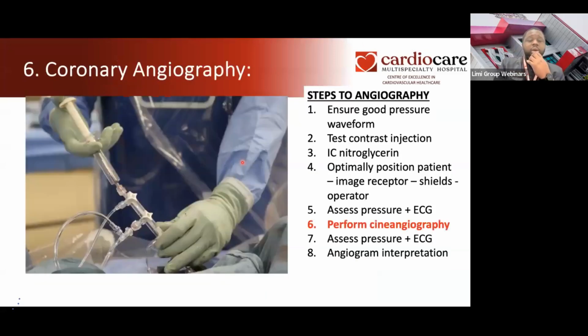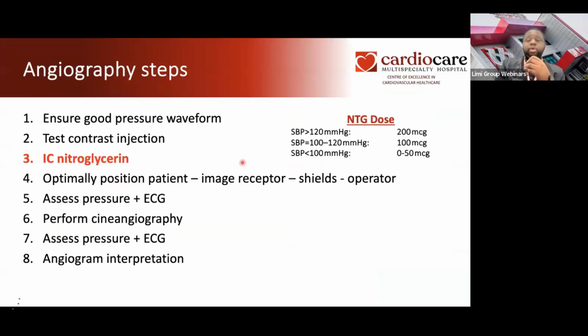Whenever it's time to do the angiogram, quite simply, most times we like to give NTG before we do that, just to make sure there's no spasm. Occasionally we don't. We've noticed that in Africans, Nigerians, you give a very small dose. This is what is written in the books. But with most Nigerians, you give a very small dose and blood pressure can crash in front of you. So occasionally we choose the patients carefully that we give this.